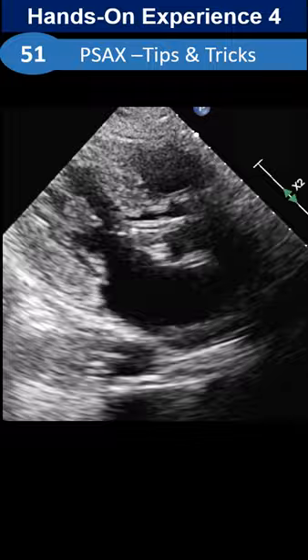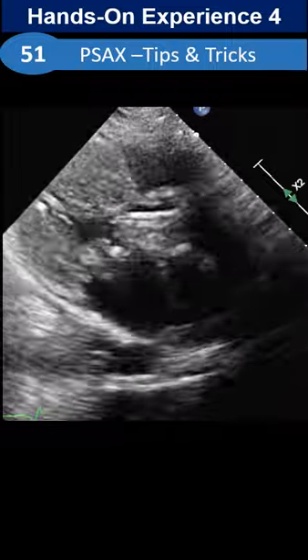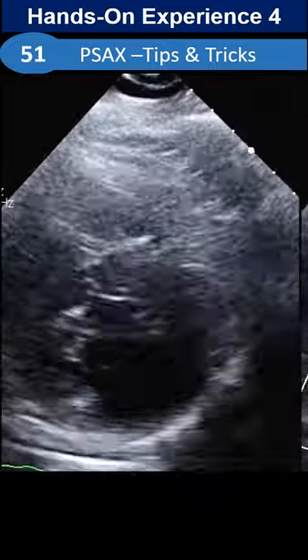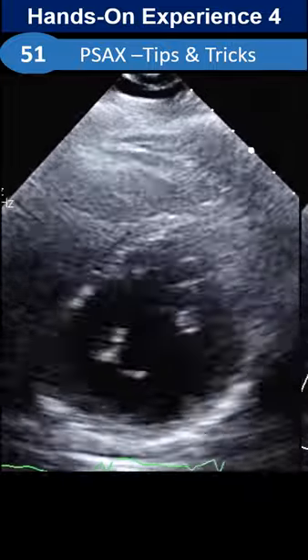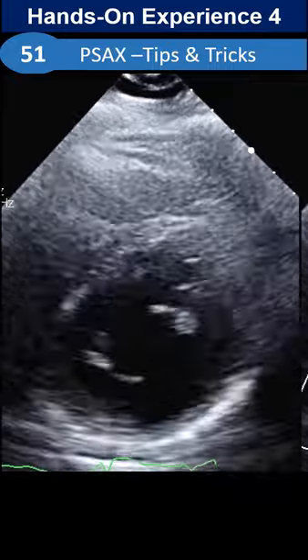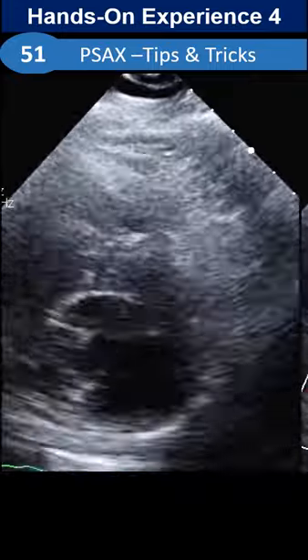PSAX at the mitral and papillary muscle level. Which maneuver? The PSAX is not correct — what maneuver do we have to do to make it correct?